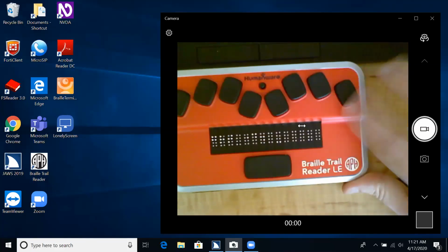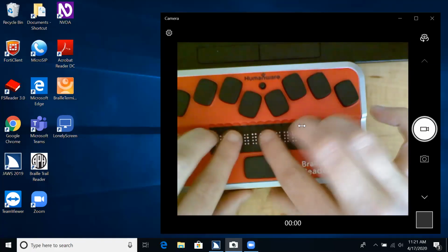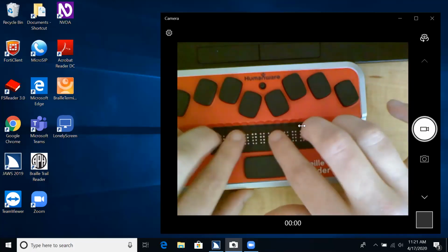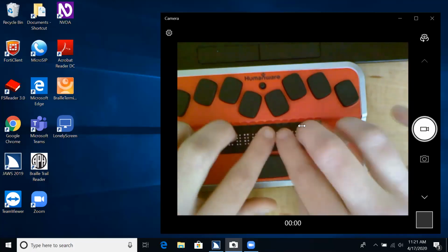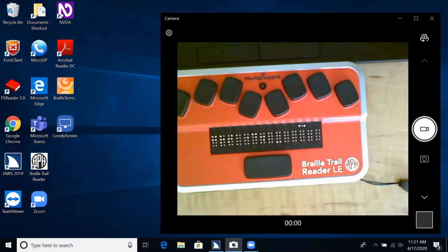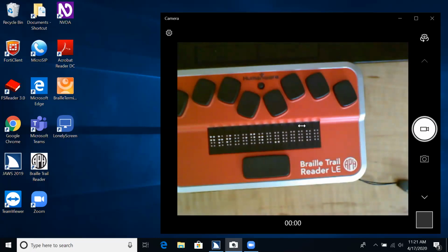I'm going to be able to use some of these navigation commands to move around this note. Remember, it can be somewhat tricky when you're working with somebody because there is no visual output here. You may wonder where your student is, and practicing in a closed file like this can help, because you can use these navigation commands and keep it in a very closed way. You're just in this file, you're not wandering out into space.